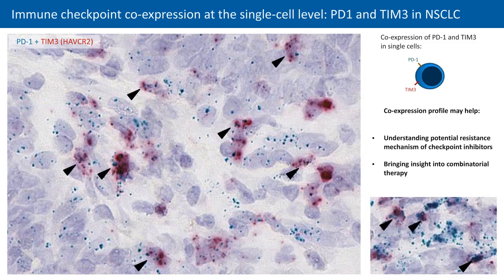This type of expression analysis could potentially offer insights into why patients become resistant to single-molecule checkpoint blockades on one hand, and also on combinatorial therapies simultaneously targeting multiple immune checkpoint markers on the other hand.